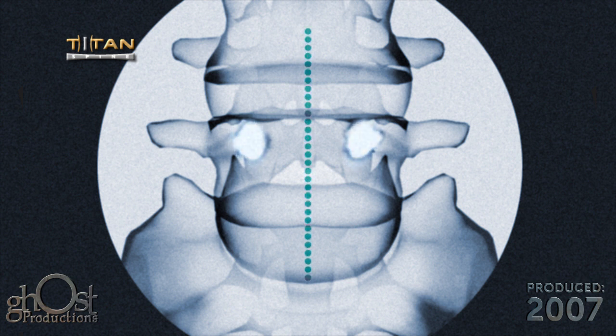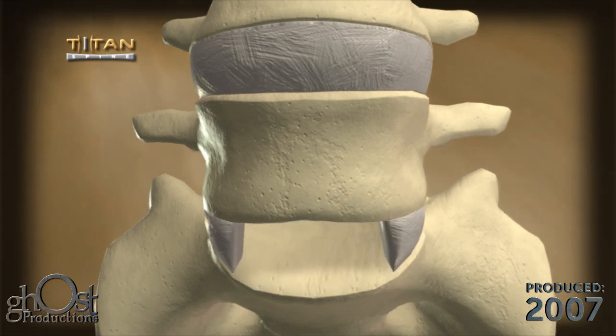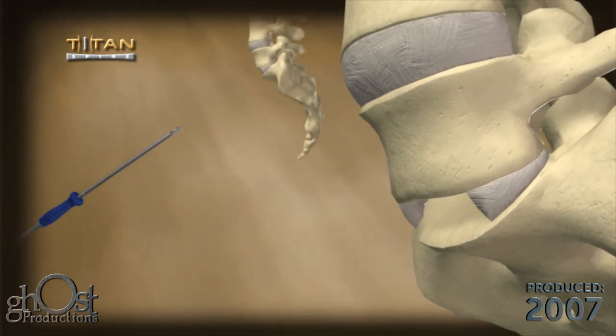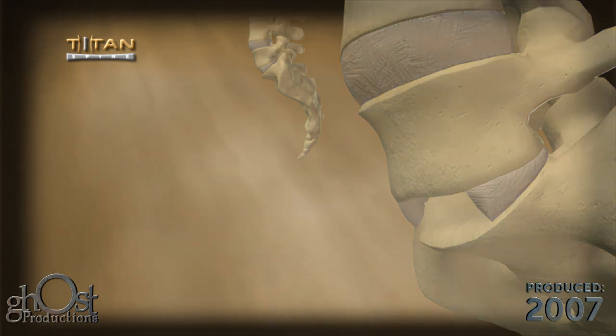from the spinous process. A discectomy is performed and the end plates are cleared of all cartilaginous tissue using a curette. An 8mm rasp attached to the threaded holder is inserted into the disc space for final cleaning. The rasp is removed using a slap hammer.